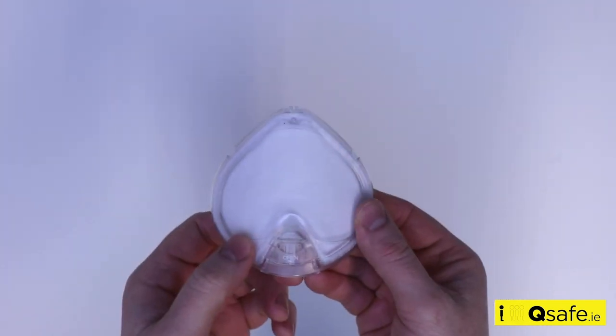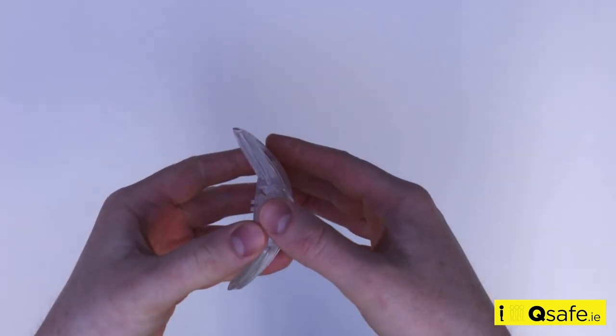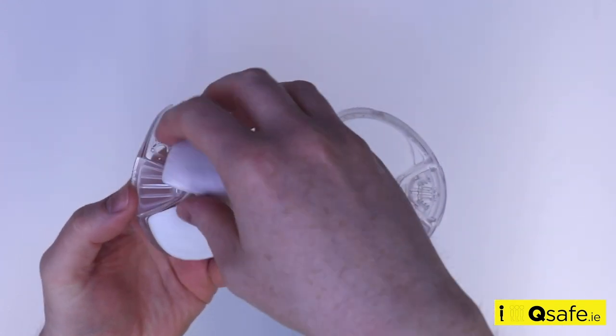Once this has been done, it can be separated by holding the mouth area and prying the two halves gently to open. When open, dispose of the filter carefully.